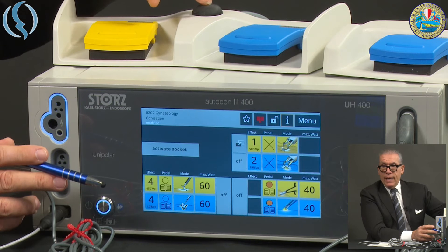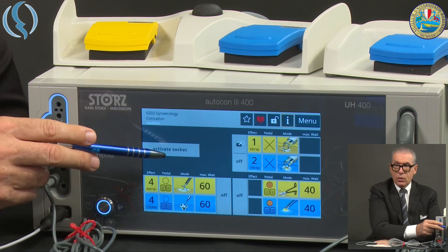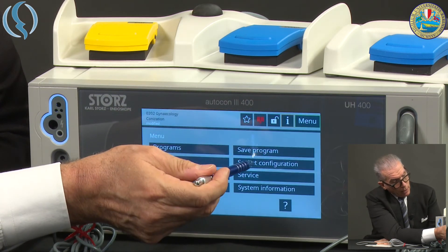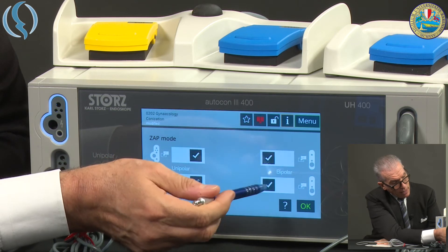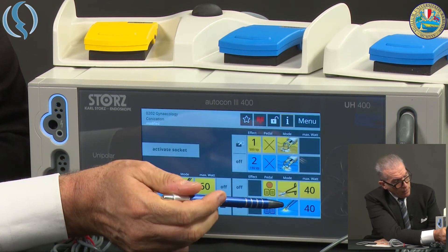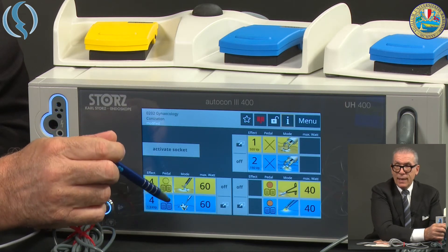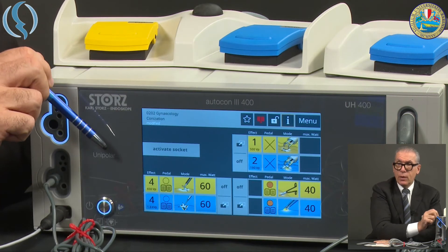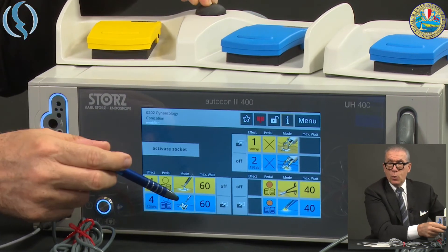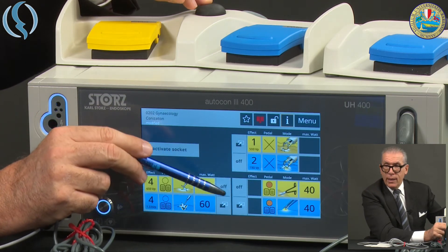Now, if I activate the zap mode on this socket and also on this socket — let me go back to the menu, back to configuration, zap mode — and I activate the zap mode for this socket and for all sockets, you see the icon appears. Depending on which pedal I assign to this specific mode, I will have the option to use the central black button to switch between unipolar and bipolar, or to switch within bipolar, or within monopolar, for the two options I choose.